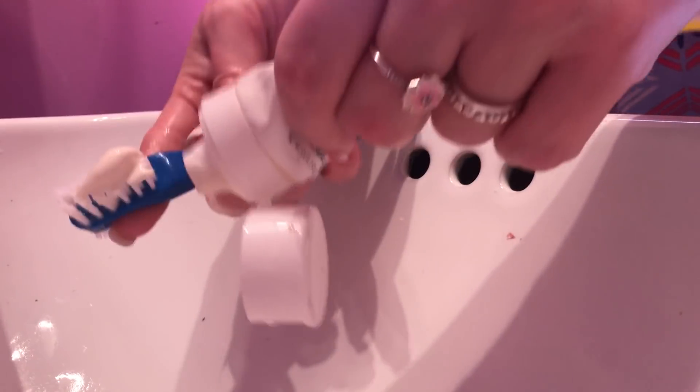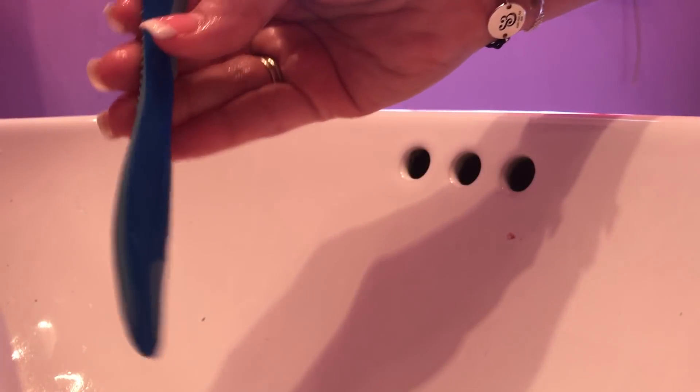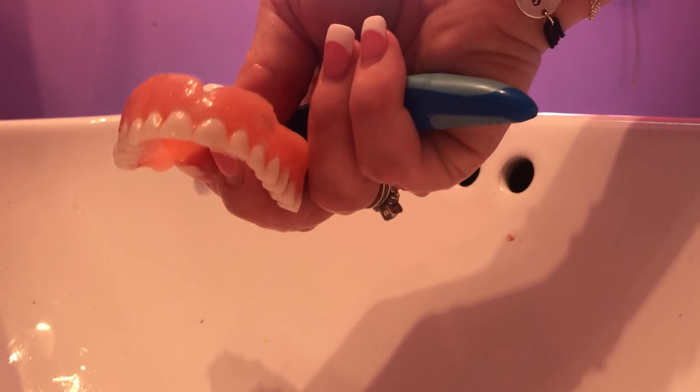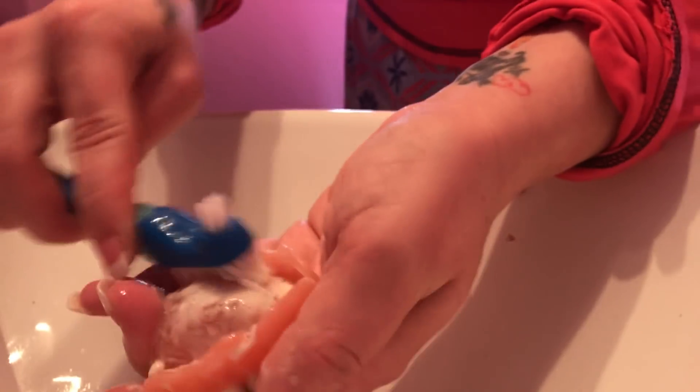I put the paste on my denture brush. Here is my top plate. I'm going to keep looking in — okay, so you clean it.